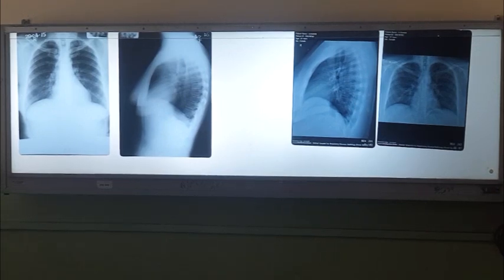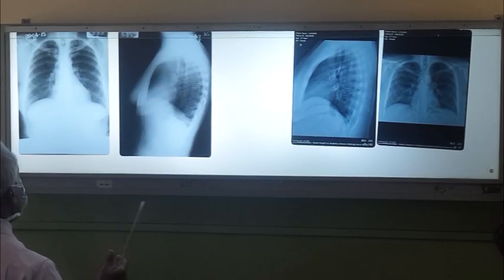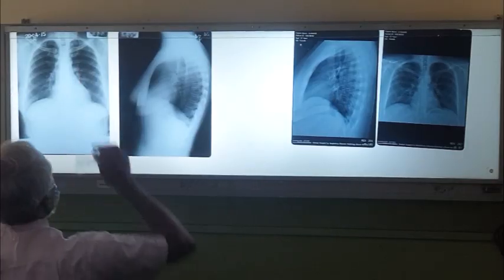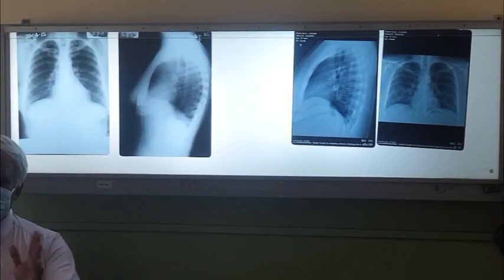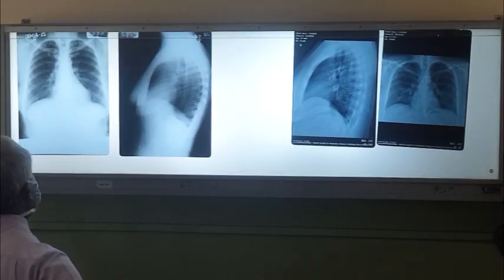And then we have the X-ray. Normally we do PA X-rays, posteroanterior. The reason is that your heart is an anterior structure. So when you do a PA film, you keep the patient in this position and get the patient to keep the hands away like this, so the scapulae won't overlap the shadows. Your X-ray source is kept 72 inches away, and it is a divergent beam. So if you keep the patient the other way, your heart shadow will show some apparent enlargement. To prevent that, we do PA film. So normally we do PA film.